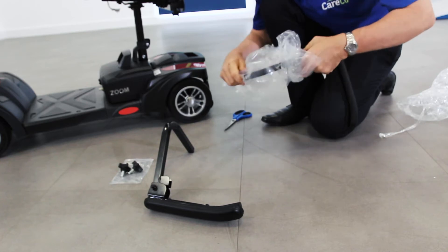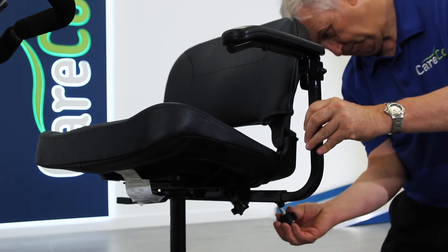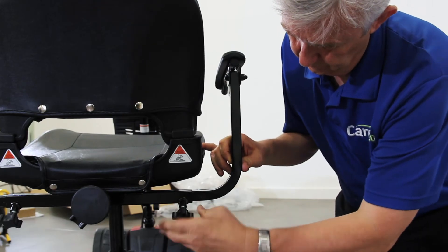Now you can slot the armrests in place. Once you have found a comfortable width on the armrests, secure them to the seat by using the knobs underneath. Repeat this process on both sides.